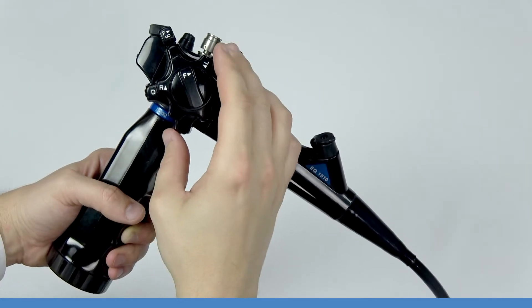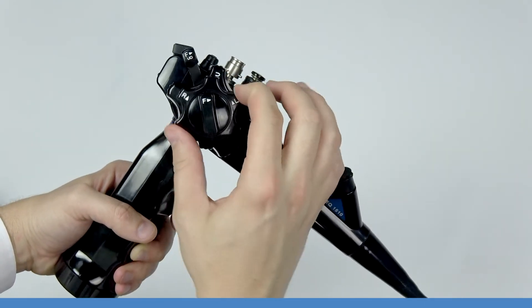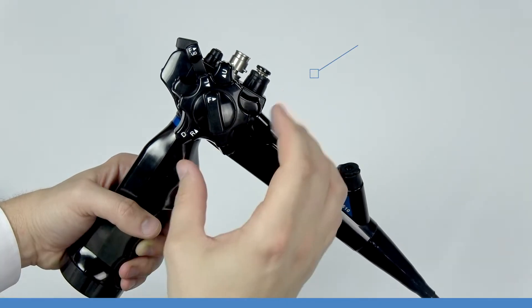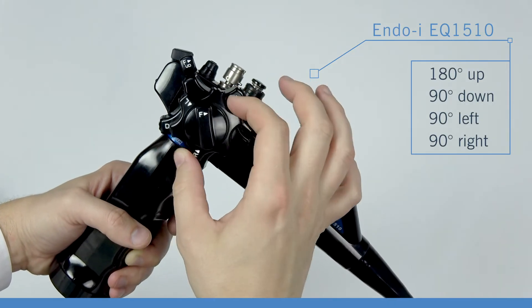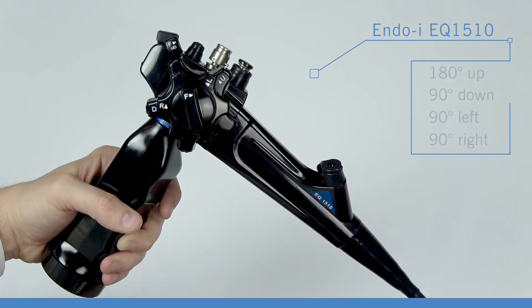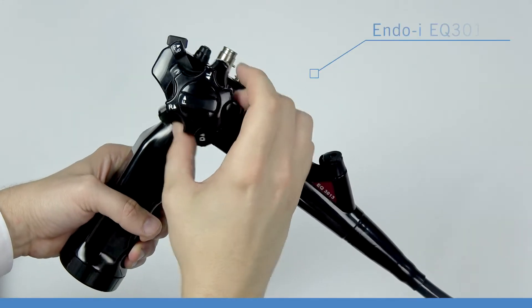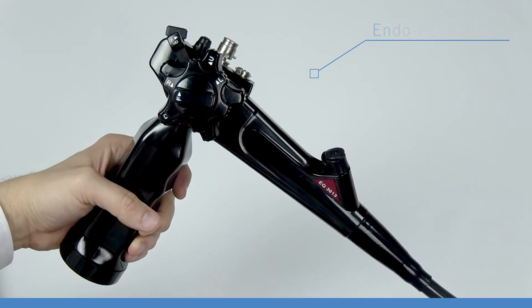While the angulation knobs and brake are the same for each scope, angulation varies slightly by model. The one and a half meter EQ1510 has angulation of 180 degrees up, 90 degrees down, 90 degrees left, and 90 degrees right. The three meter EQ3013 features angulations of 180 degrees up and down, and 160 degrees left and right.